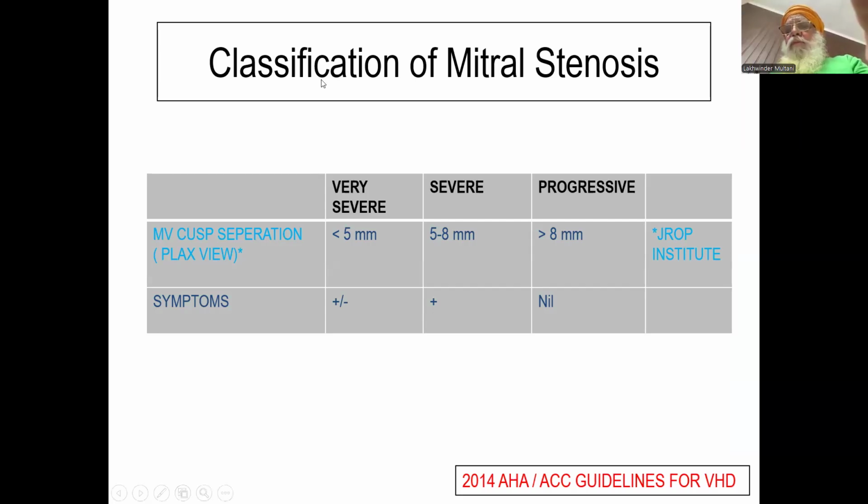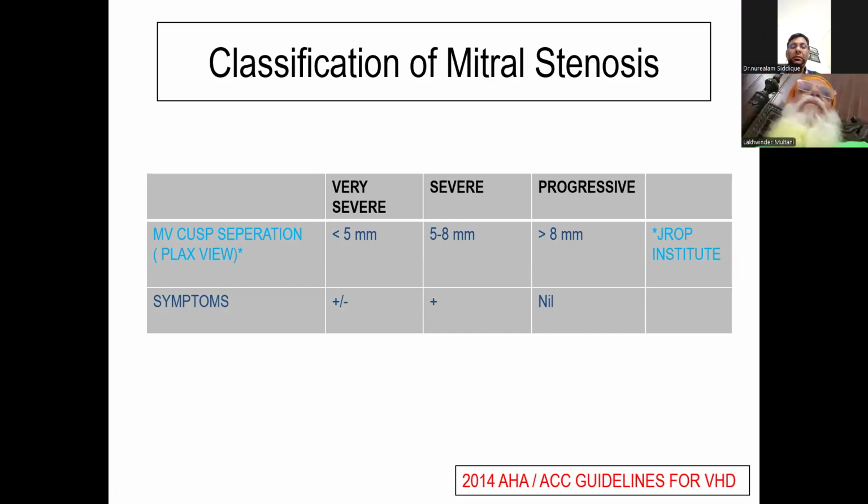Dr. Neeraj Jodhke again. Sir, when we say that the calculation of mitral valve area by planimetry is more specific, then when do we need to calculate the area by continuity equation? Question. What happens, Neeraj? Everything is not straightforward in all the cases. I can quote an example of a patient. His mitral area was 1.2, 1.3. The patient was having recurrent dyspnea, like PND, paroxysmal nocturnal dyspnea.